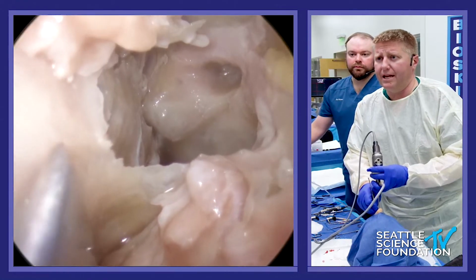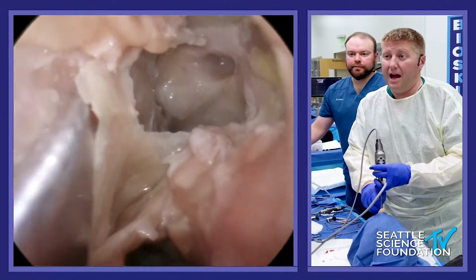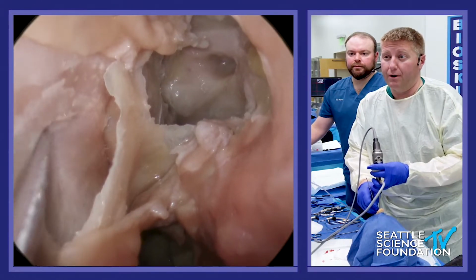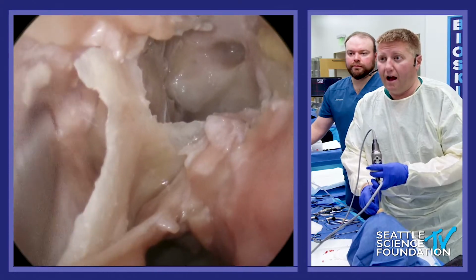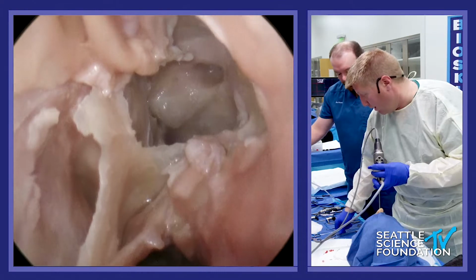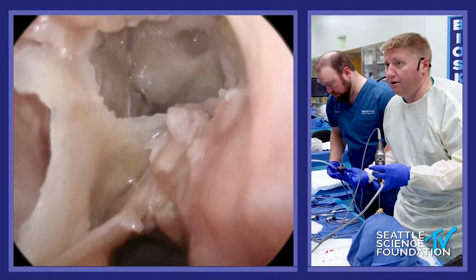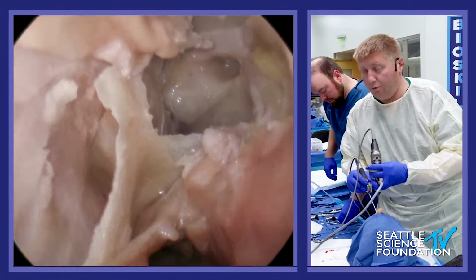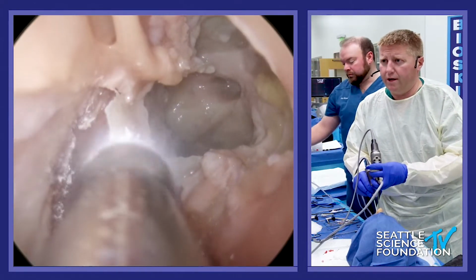Now, the extent to which you're going to go through this posterior septum depends on how much room you have, what's your experience with it, what's your working relationship with this neurosurgeon. I find that when doing these, the neurosurgeons always want more. I always want a little bit less. And I argue that, well, they don't have to see their nose post-op, and we do. So at this point, we're going to try and drill this down.